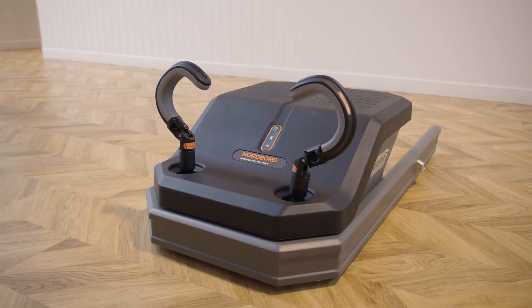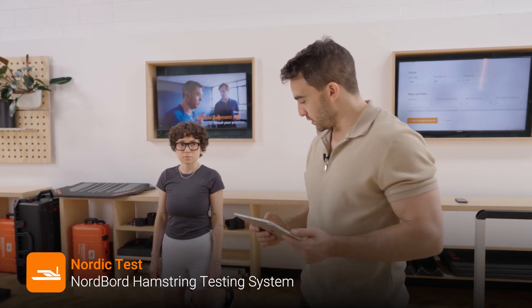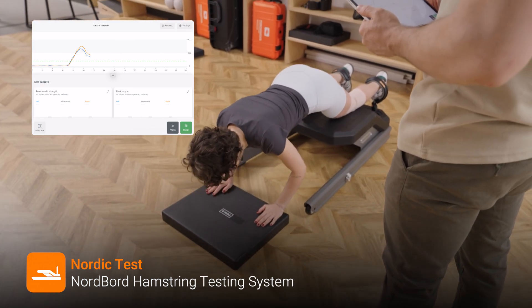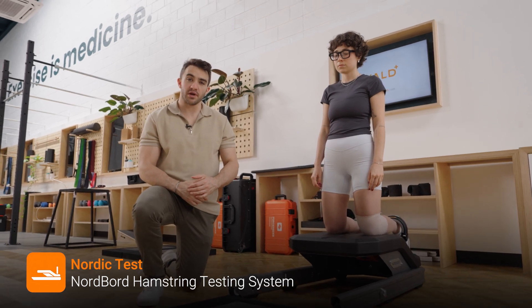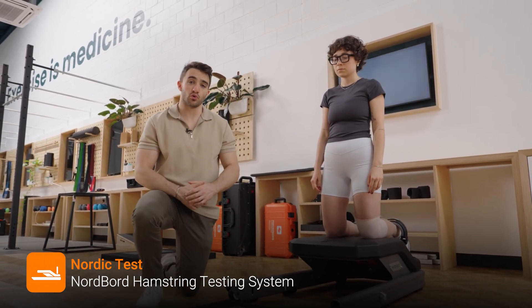Because Louisa's surgeon will be using a hamstring graft, it's important that we assess Louisa's hamstring strength using the NordBoard. Because hamstring strength is typically impaired following a hamstring graft, I've prescribed Louisa some strength exercises using NordBoard training mode.